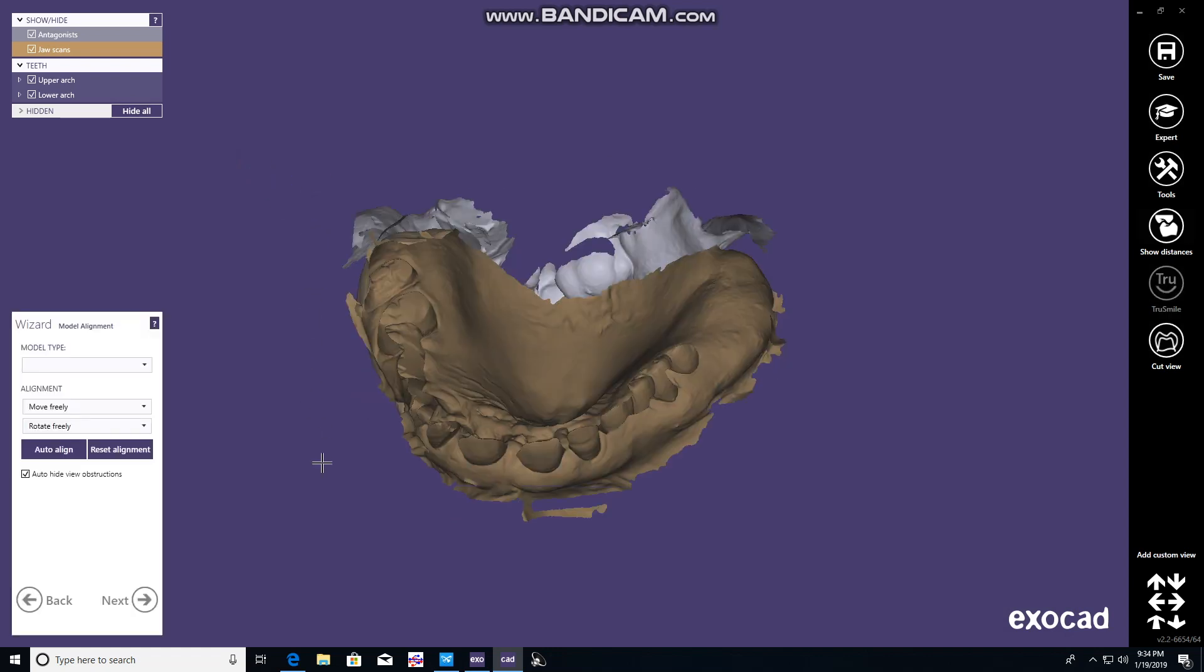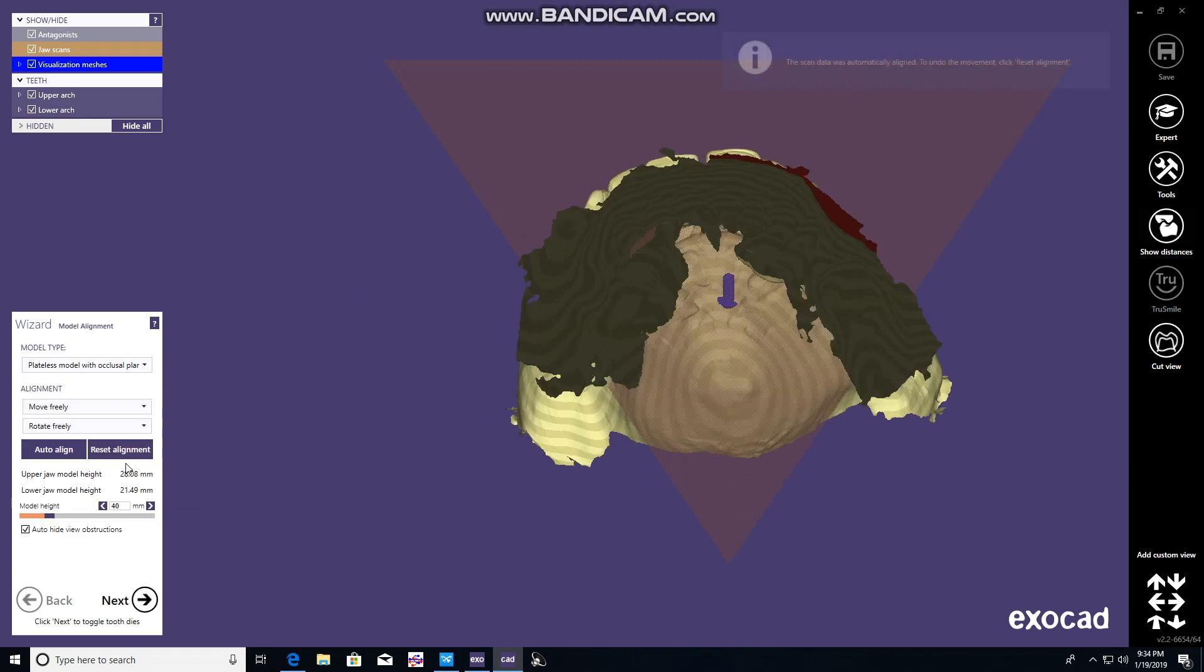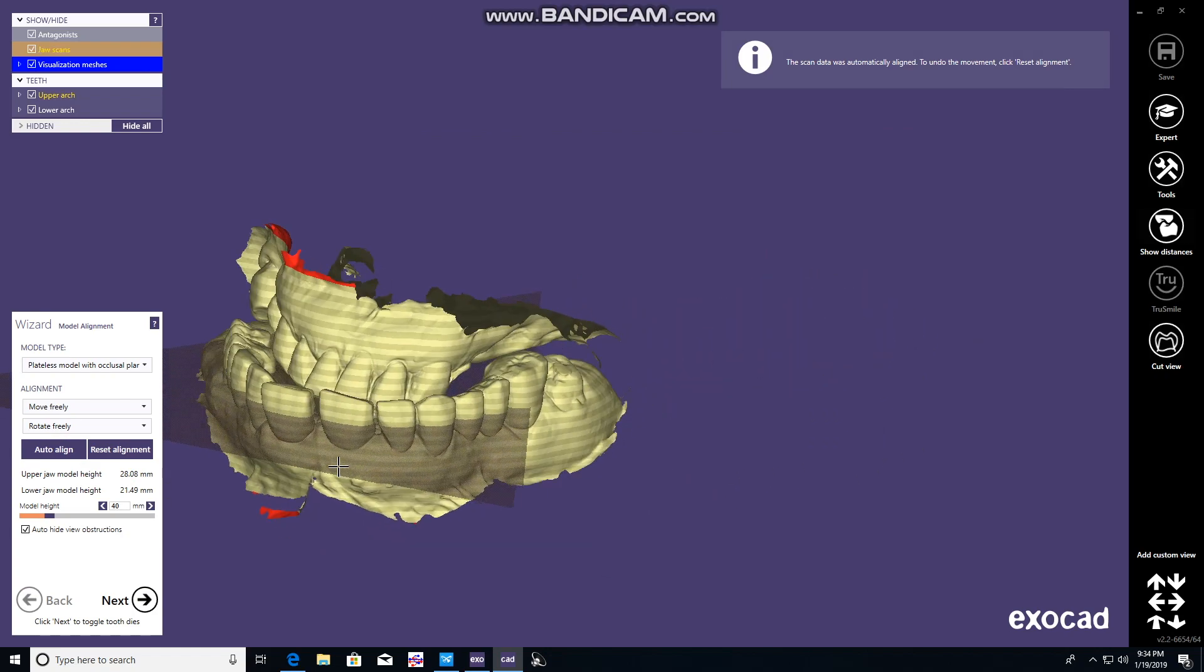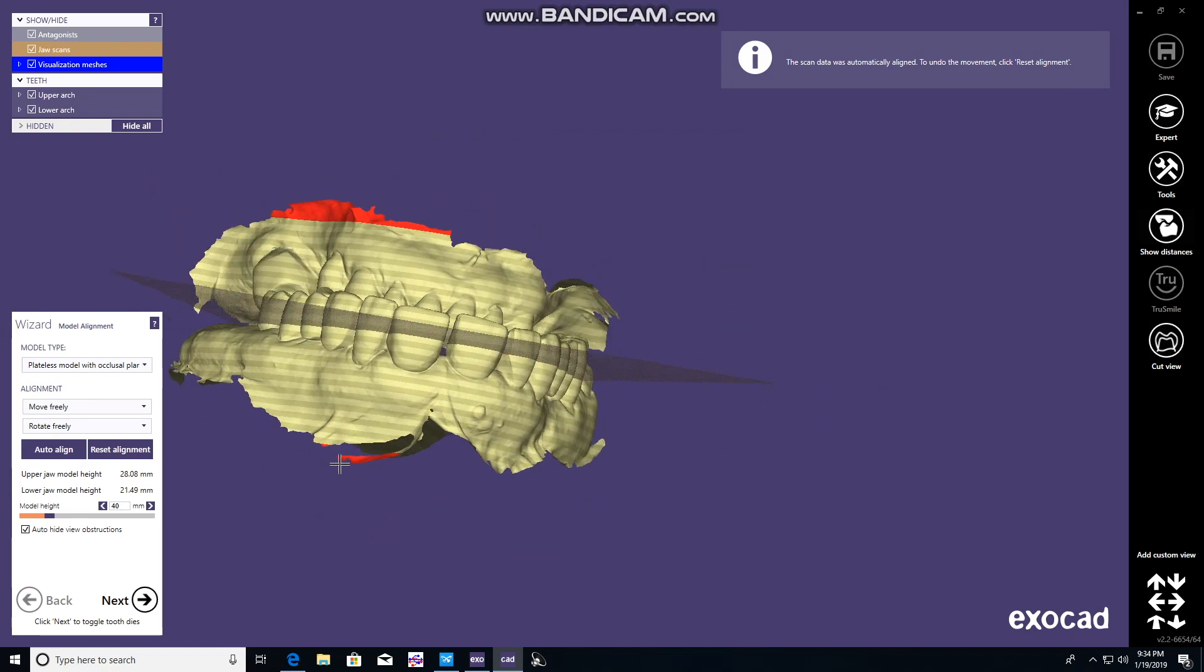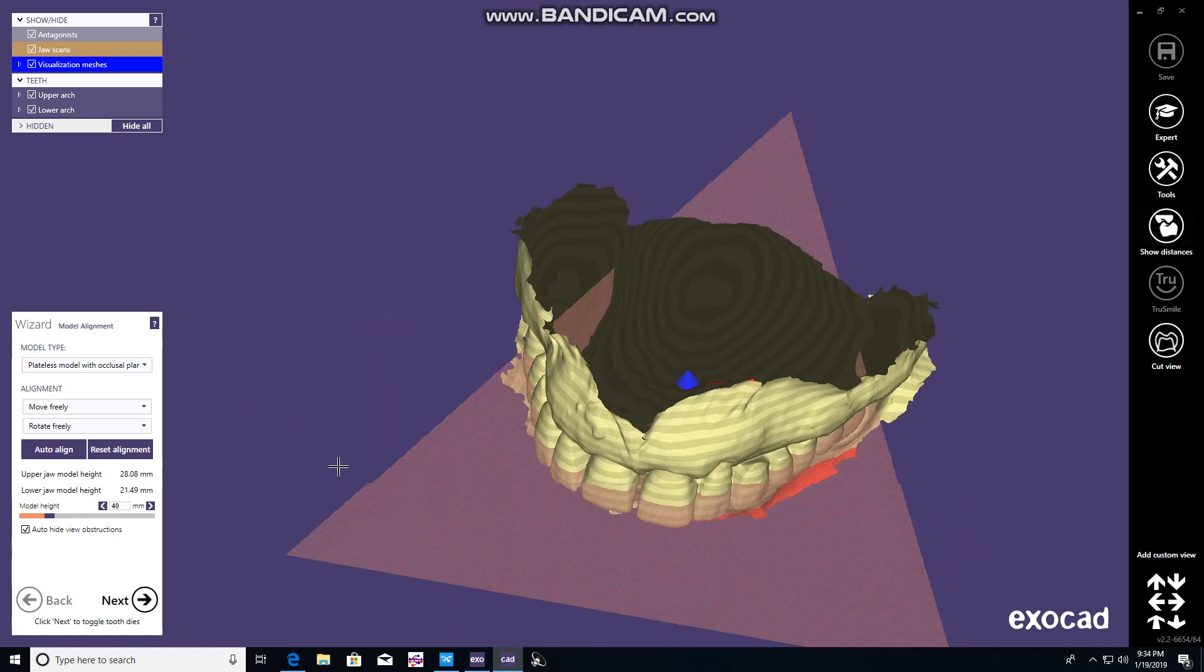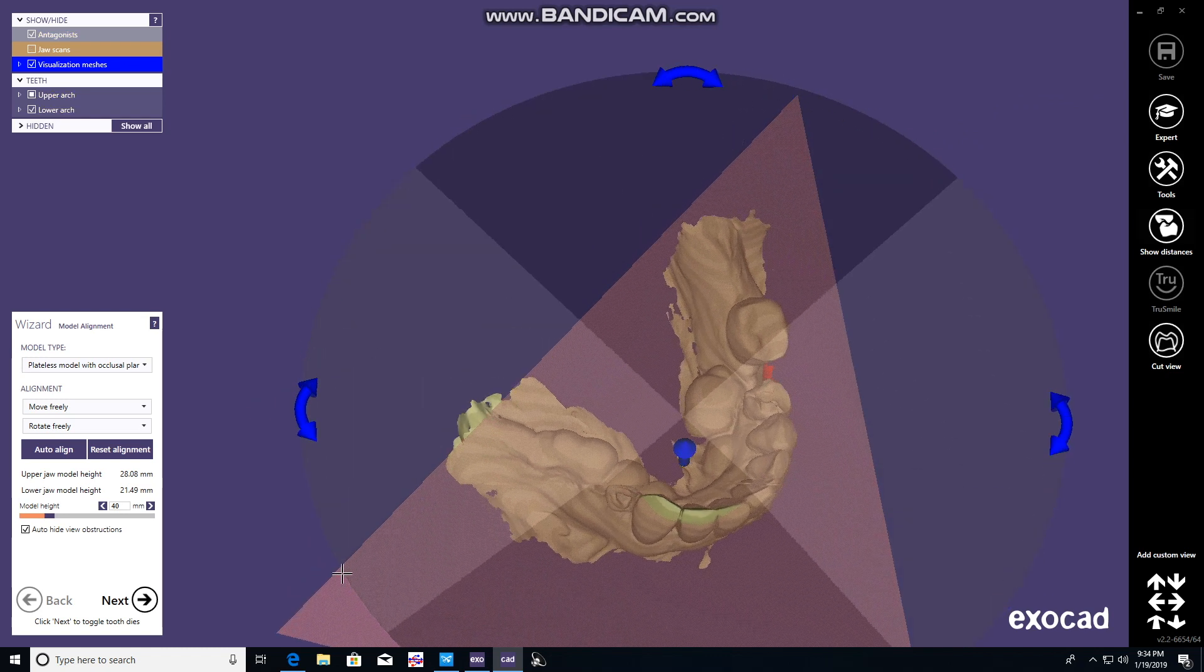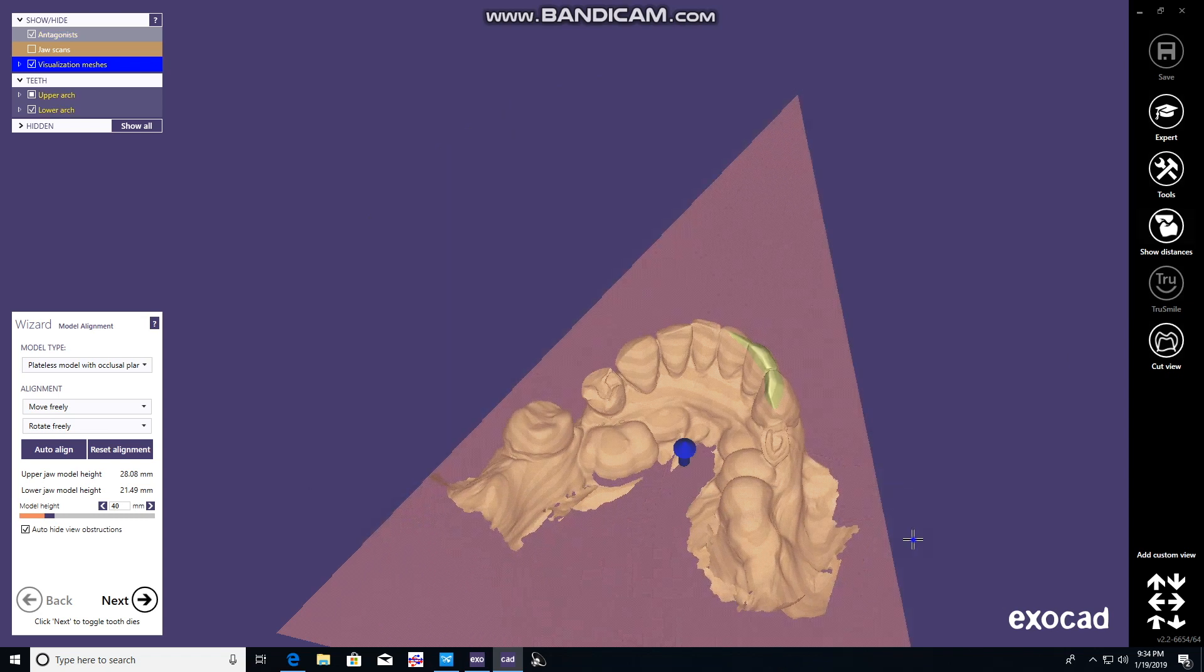Now it takes you through the wizard, where we pick palateless model with occlusal plane. You can auto align it if you'd like, or manipulate it to adjust it. In this case, we will manipulate it. You can move it up and down, right and left, and hold control down to spin it around.